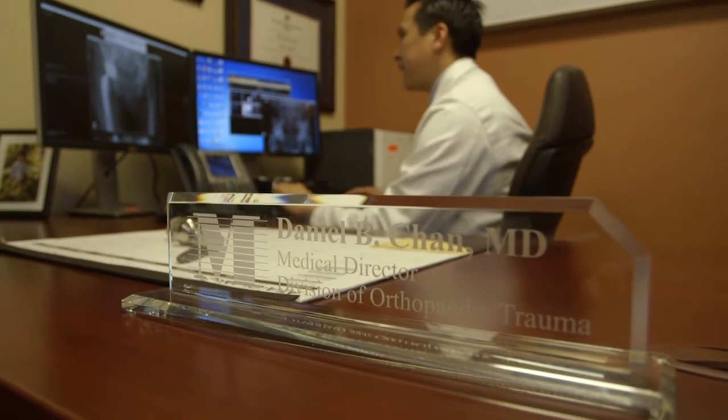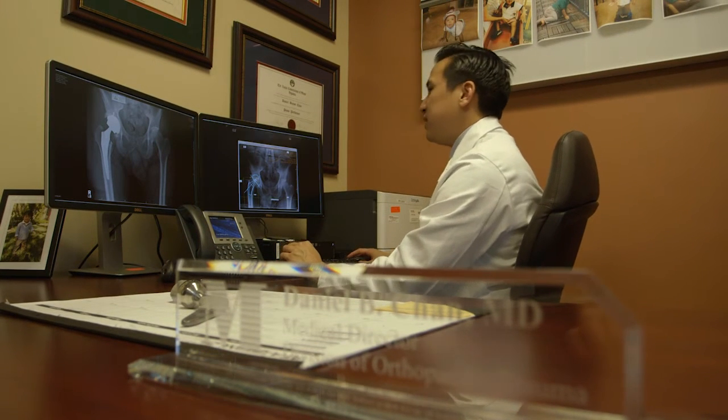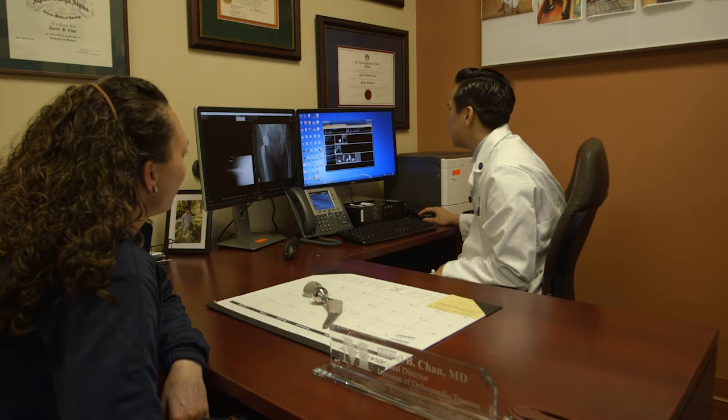The potential benefits of doing the hip replacement through an anterior approach include the ability to use X-ray, live X-ray or fluoroscopy throughout the entire procedure. This guarantees that the implants are put in at the correct inclination and rotation and alignment. And the most important predictor of longevity of a hip replacement operation is the appropriate alignment and position of the implants. I think the biggest misconception that people have who are suffering with hip arthritis is that it's a prolonged recovery and a painful procedure.